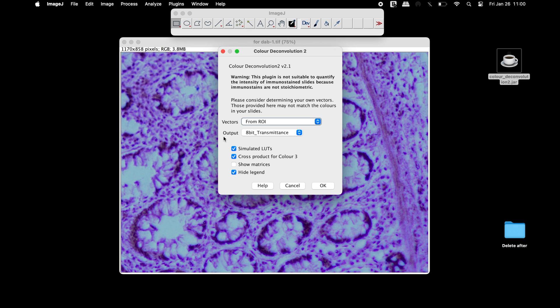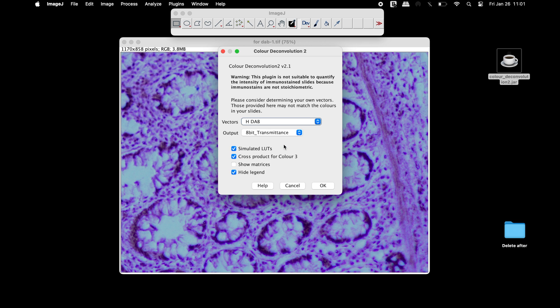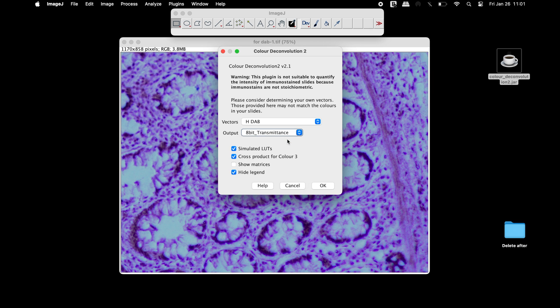In the Color Deconvolution 2 window, select the vector from the drop-down according to the image type. In this tutorial, let us select hematoxylin and DAB. In the output, select 8-bit transmittance. The rest of the parameters can also be selected if required. Once all the parameters are set, click OK.